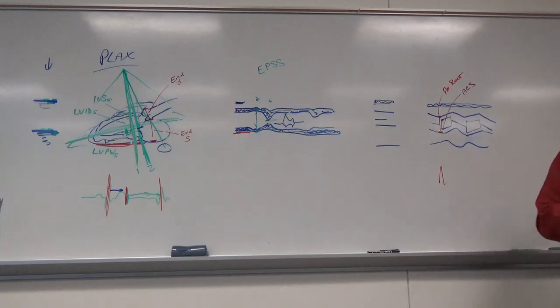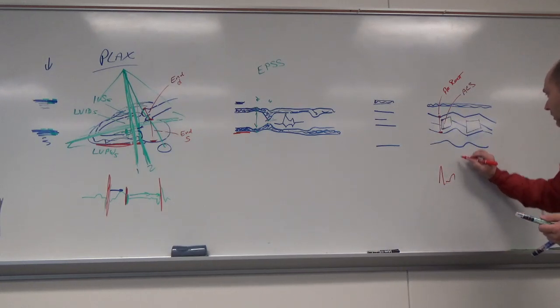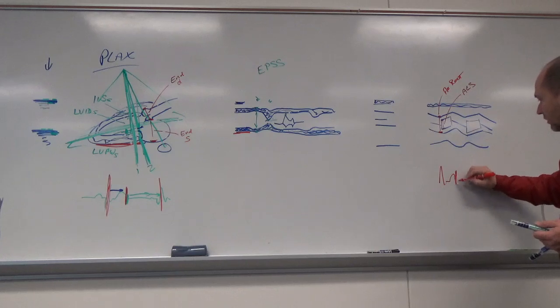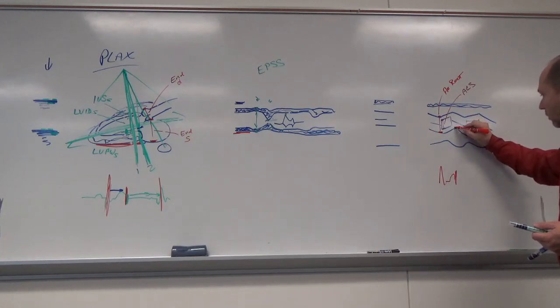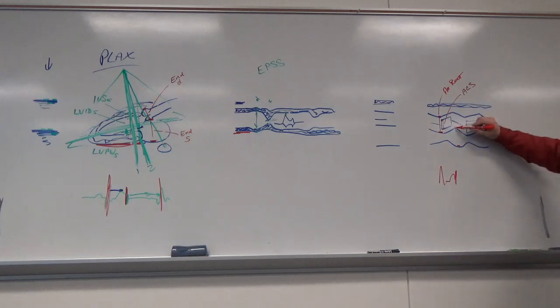Okay, and then my LA, I want to measure the left atrium when it's its biggest. When is it the biggest? Systole. So at the end of systole, so we've got the T wave. It's going to be right at the end of the T wave for this, at the widest portion. Leading edge to leading edge. So we're going to get these three measurements on that M mode.